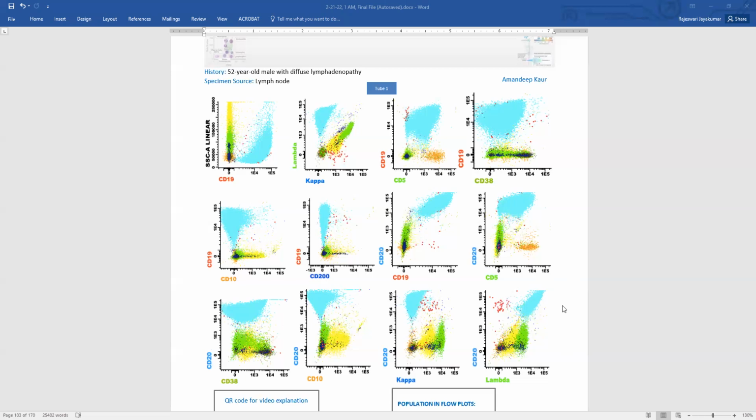And the other one is that prolymphocytic leukemias can have a picture like this. They can be CD5 positive, and those are large cells too. So these are the things that you have to keep in mind.